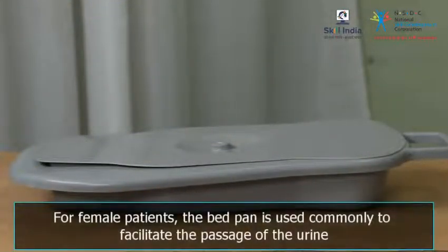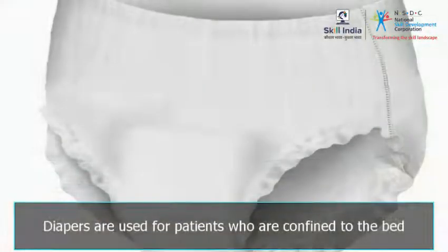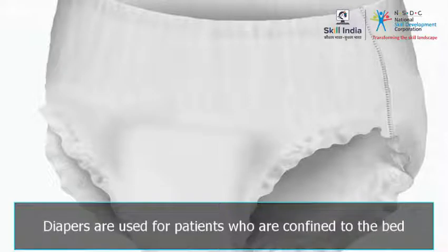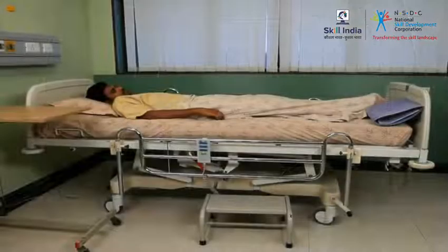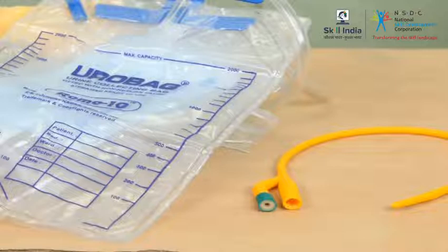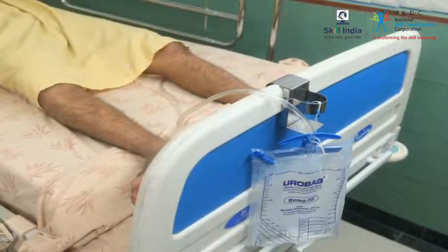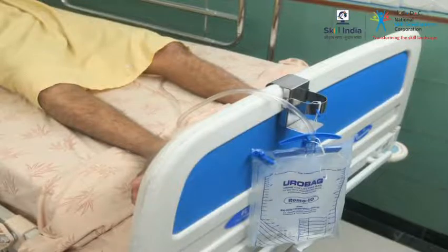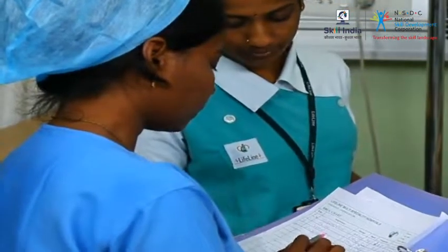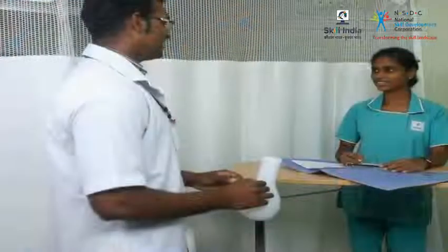For female patients, the bedpan is commonly used to facilitate the passage of urine. Diapers are used for patients who are confined to bed and are unable to express or control the need to urinate. Catheters are tube-like equipment inserted directly into the urinary bladder to empty urine directly from the bladder. Based on the patient's condition, the doctor will suggest the appropriate equipment. You must check with the nurse or doctor for the type of equipment to use.